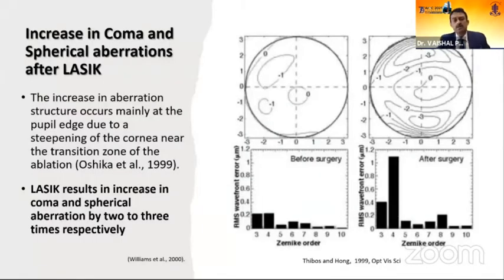So most important is when to customize and when to correct is in corneas post refractive surgery, where the aberrations and the coma increase by 2 or 3 folds. This is when, if you want to put a premium IOL, these are the cases which are the non-virgin corneas, where you have to be very, very careful. Otherwise, you can have a very unhappy patient post-operatively.